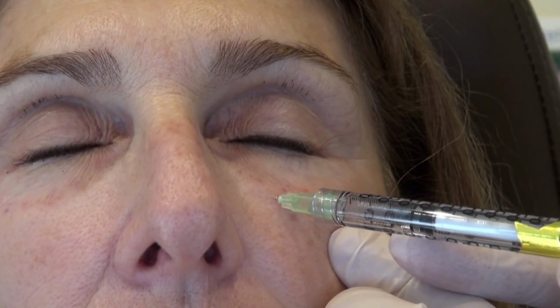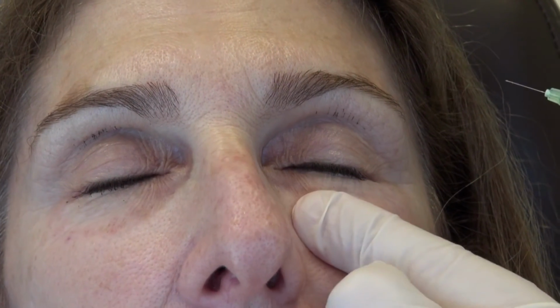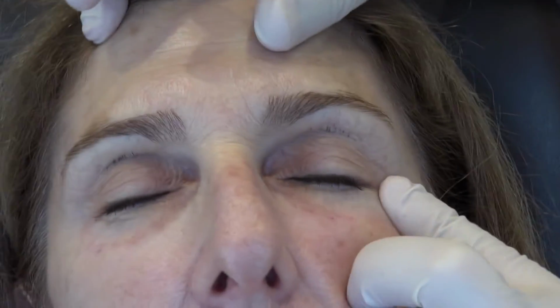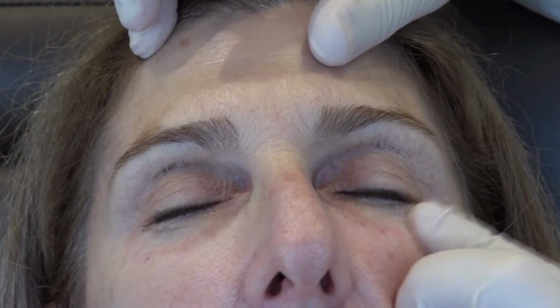Okay. Little stick here. Can you see it? Yeah, okay. Again, I'm deep. I'm moving. Okay.